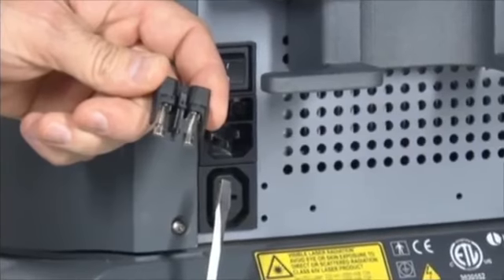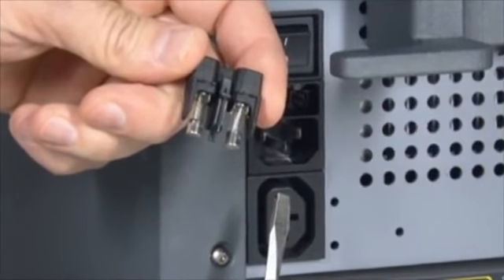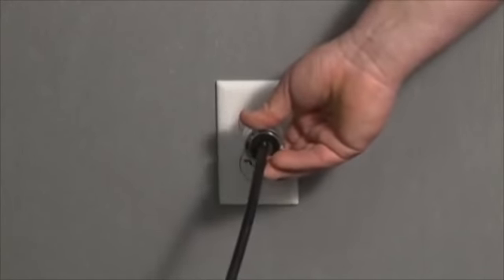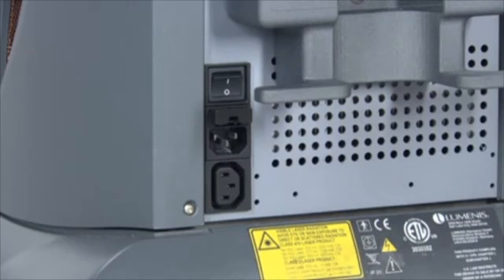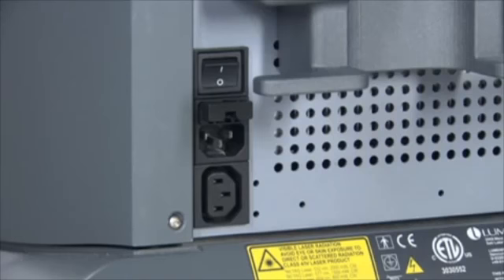It is possible that the fuses on your Vision 1 system may occasionally need to be replaced. To replace the fuses, begin by turning off the system. When making any repairs or performing any maintenance such as replacing the fuses, remember to remove the power plug from the wall receptacle and unplug the cord from the system's main power receptacle. Ensure that the key switch is in the off position. Ensure that the main power switch is in the off position.